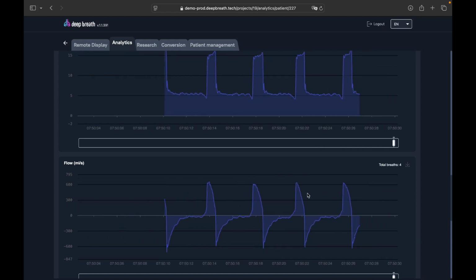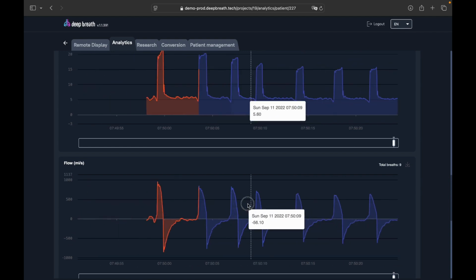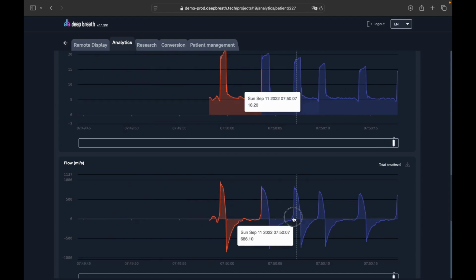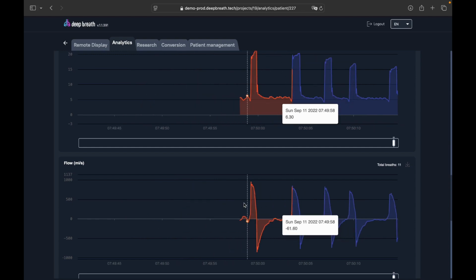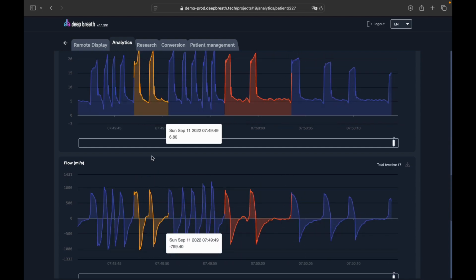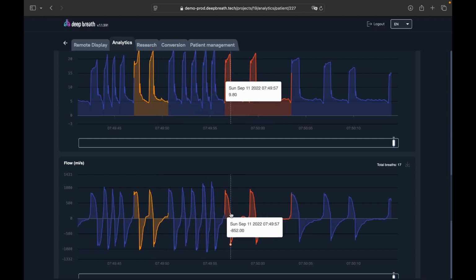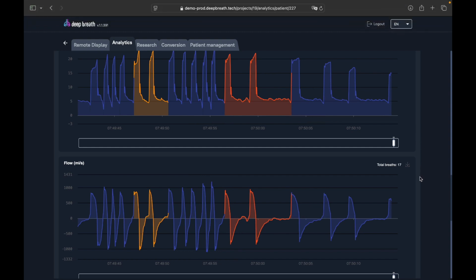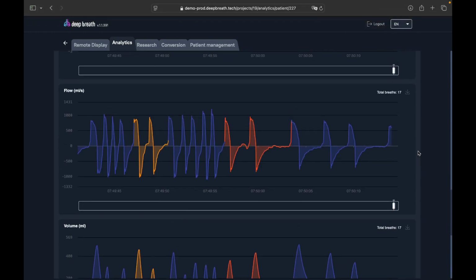That was really difficult, and we're really proud that currently we don't provide false positives because of cardiac oscillations, but we still detect both late triggering and failed triggering cycles even in a heart condition, and we hope it will help to improve treatment.